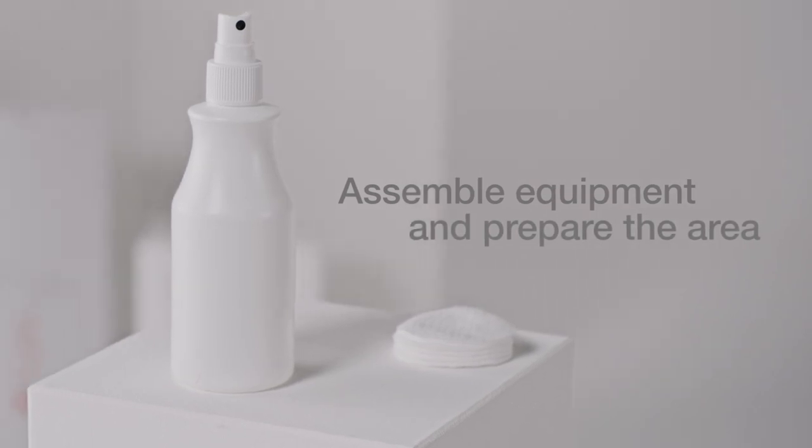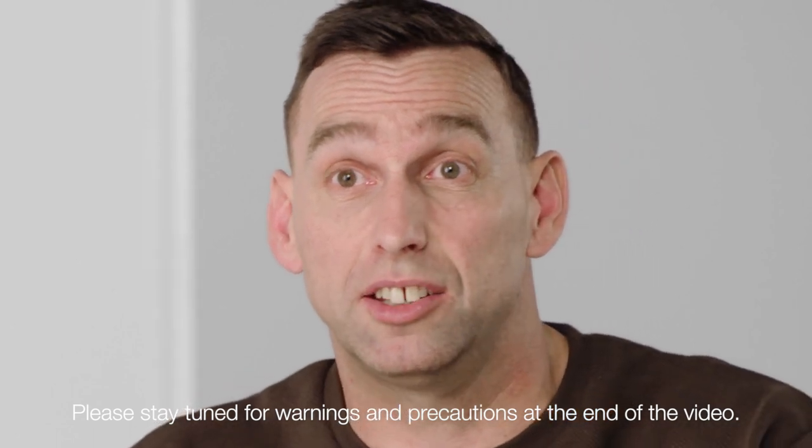Assemble all equipment and prepare the area, making sure that everything is to hand — regardless of whether I'm in a field or in a bathroom.